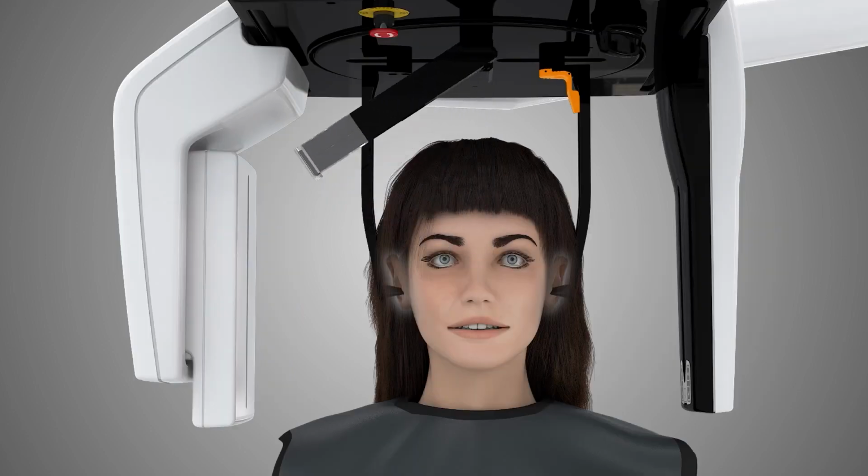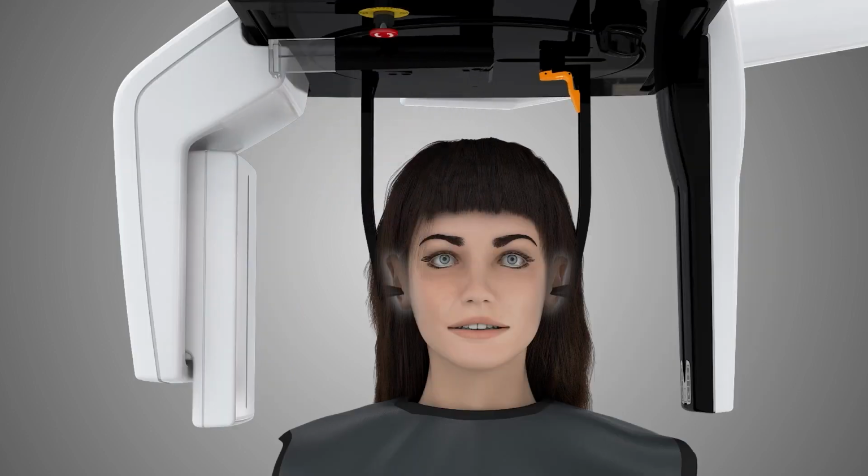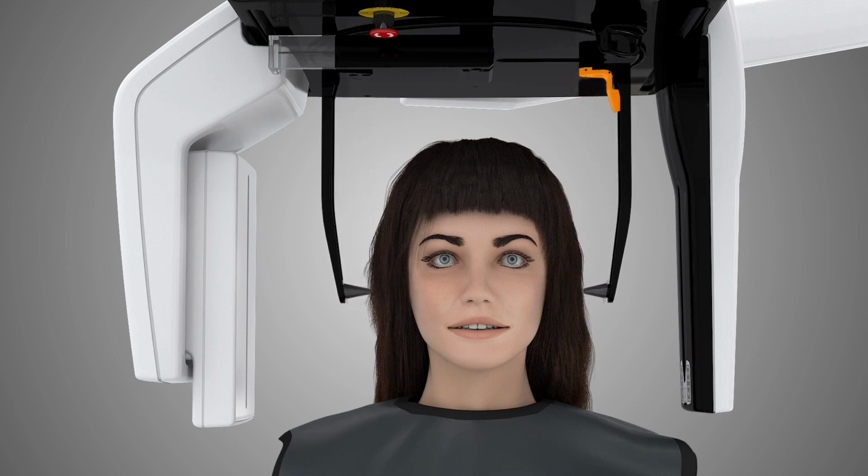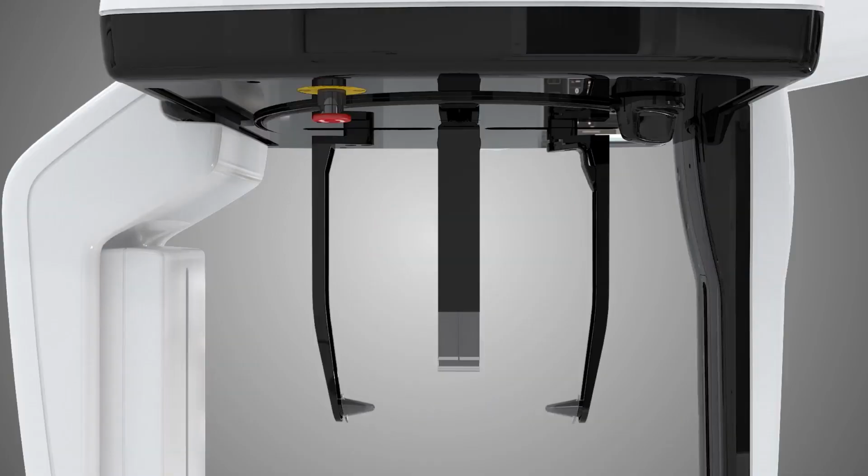Pivot the nasion support into its uppermost horizontal position. Press the ear rod brake button, slide the ear rods away from the patient, and guide the patient out of the unit. Remove the disposable ear rod covers and disinfect the unit according to the directions in the user manual.